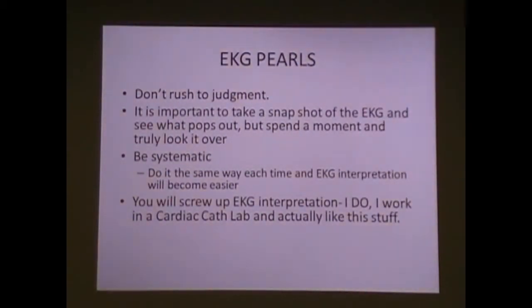You know what? Everyone's going to screw up EKGs. I work in a cath lab. I screw them up. I get schooled by my cardiologist more times than I care to admit. We all have to learn from this. And as I said, you put three cardiologists in a room, they're going to argue over something. And again, the overlying theme for today: treat the patient, not the paper.